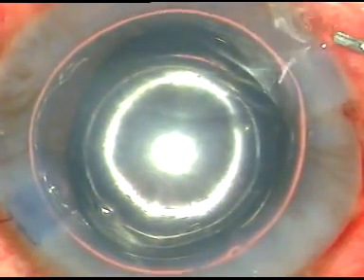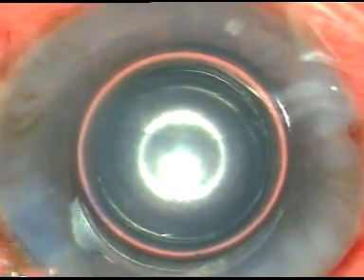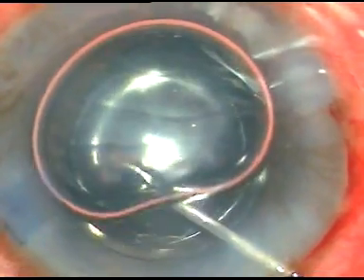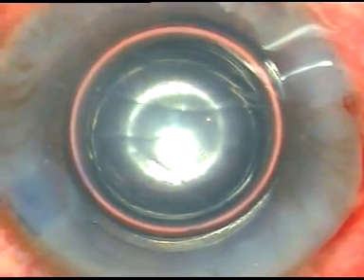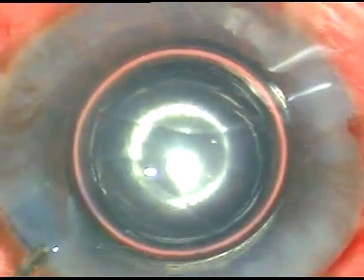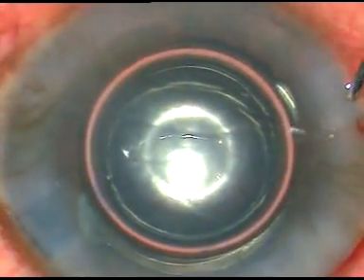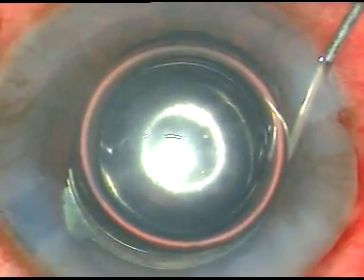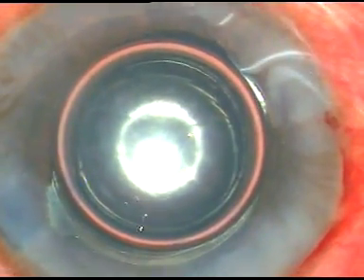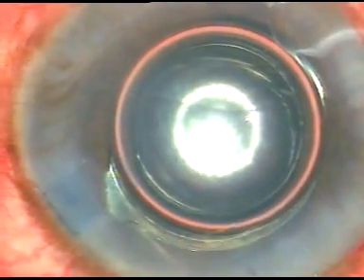This is pilocarpine. Pilocarpine is being injected under air. Some moxifloxacin and pilocarpine has been injected.